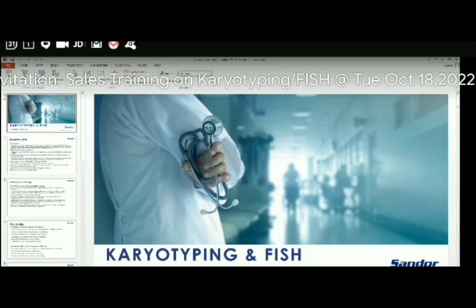It is not like biochemistry or any other department, where if you give a sample the report will be released with some values, but if we take the sample again after 1 hour, the reading will be increased or decreased. In cytogenetics, it won't happen. It will be static. If we get a result once, the same result will appear. If you perform the same test after 10 years or 20 years or 50 years also, the same result will appear. It won't have any changes.